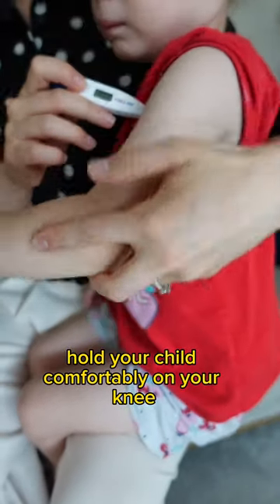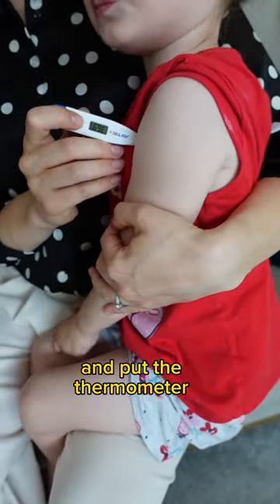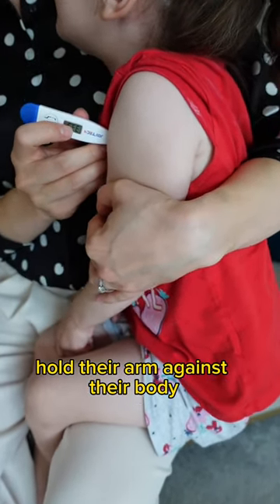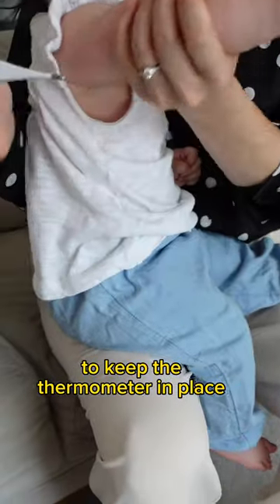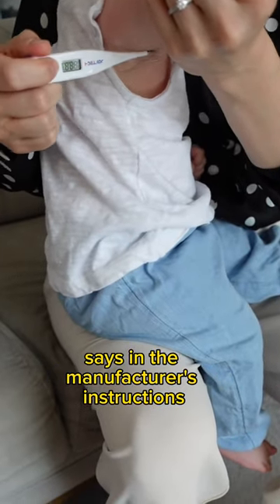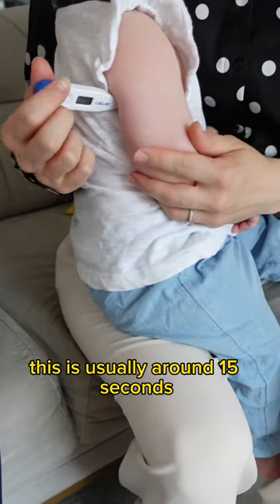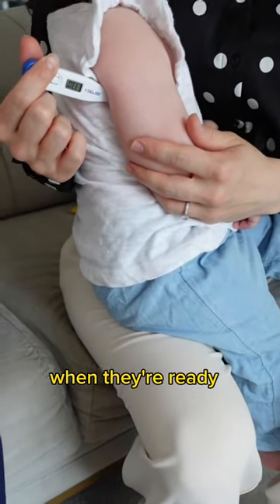Hold your child comfortably on your knee and put the thermometer under their armpits. Gently but firmly hold their arm against their body to keep the thermometer in place for however long it says in the manufacturer's instructions. This is usually around 15 seconds. Some digital thermometers beep when they're ready.